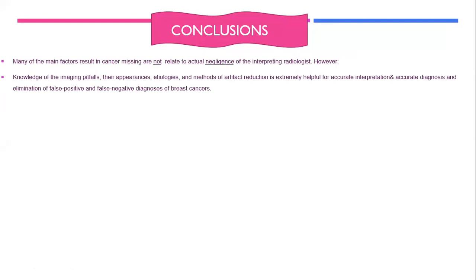Okay, so in conclusion, many of the factors for breast cancer misses are not related to actual negligence of interpreting physicians. However, knowledge of imaging pitfalls, their appearance, etiologies, and methods of artifact reduction is extremely helpful for accurate interpretations and accurate diagnoses and elimination of false positive and false negative diagnosis of breast cancer.